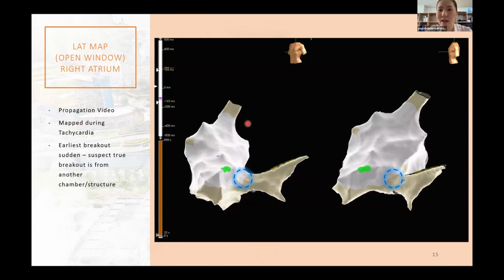That was an excellent, interesting, and educational case, and I really enjoyed it. I have a few questions because I'm a new electrophysiologist, so I don't understand something and I have to clarify. What do you think was the underlying electrophysiological mechanism responsible for the wobbling phenomenon? And which finding convinced you that this was AVRT rather than another form of SVT?